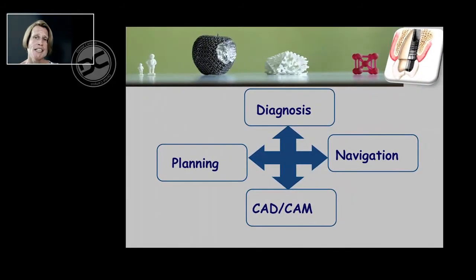Cone beam CT is interesting in implant dentistry not only because it offers a diagnostic value in 3 dimensions, but also because it offers multiple other options related to the therapeutical approach, such as pre-surgical planning and integration of the implant placement, navigation tools, and CAD/CAM productions. And it is those different components that make the cone beam so popular in dental practice.